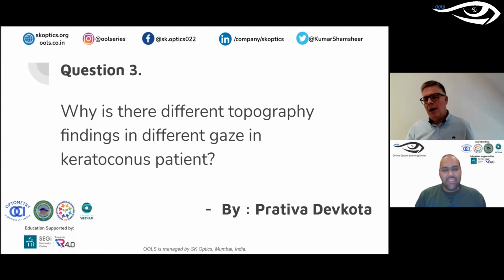And do I need a Pentacam to look at the posterior cornea? Well, the answer is yes, we need all of those. But what we're trying to stress today is that there is such a massive jump from keratometry up to the very basic levels of corneal topography. Yeah, that's exactly the agenda and the thought process which we wanted to do.